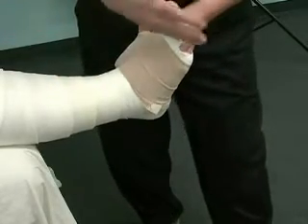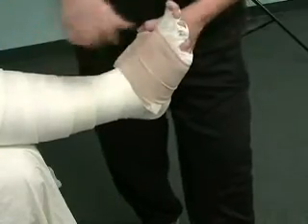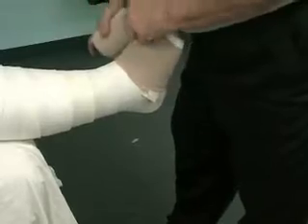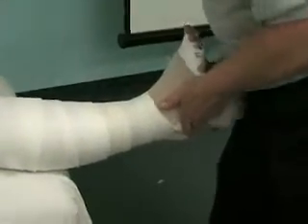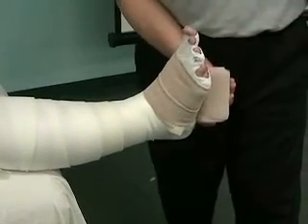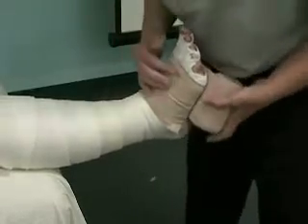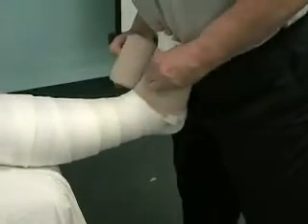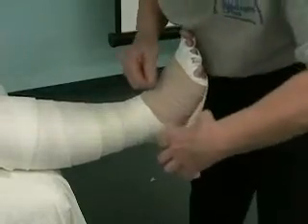I like to go up higher so then when she's standing, if the bandage stops here, it's like a casting effect. If I use a bandage that's only 5 meters long, I'm not having enough length to really do what I want to do. Plus, if it's a big foot and I need to go around more, I'm able to catch the heel a lot easier with one bandage. I don't want bulk. One of the biggest things you don't want is bulk. So it's still 3, and now I'm better positioned.